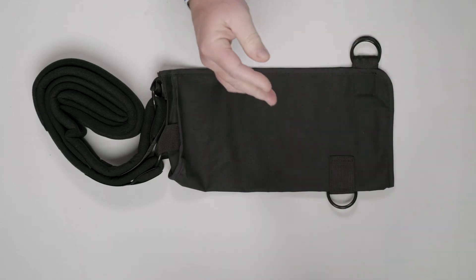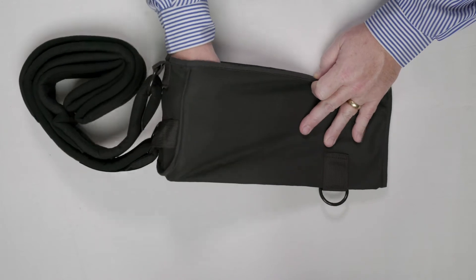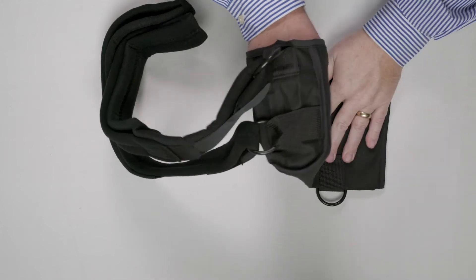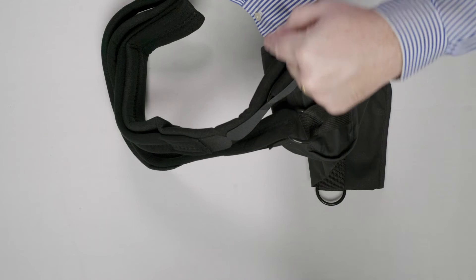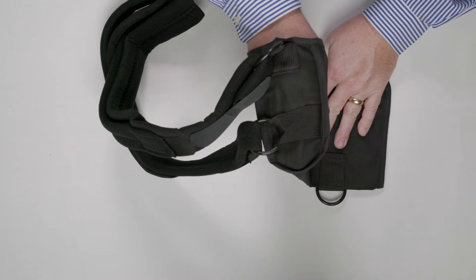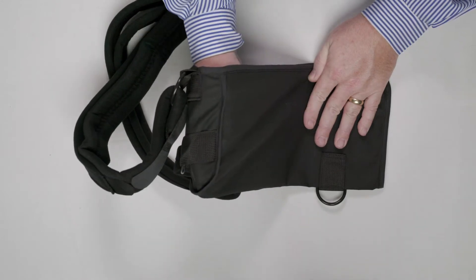The unique thing about the Gus arm sling is that we've built a gusset into the brace — you can see it here right on the end. Rather than have a completely flat line, we've actually inserted this piece of material, called a gusset, into the back of the arm sling. This allows the sling to contour better to the back of the arm and allows the elbow to seat into the sling.